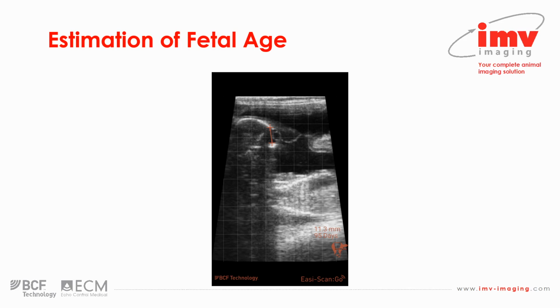So we can be confident that we're looking at basically the zygomatic arch and lateral wall of the skull there, and then we can see the lens of the eye, so we know we're measuring the globe diameter between those calipers. It's not very easily discernible, but in the bottom right corner of that still you can perhaps make out the measurement 11.3 millimeters, and correspondingly 95 days, and the little logo there just reminds you that you were measuring cattle orbit diameter, to ensure that you haven't selected the wrong measurement and made a bit of an error.